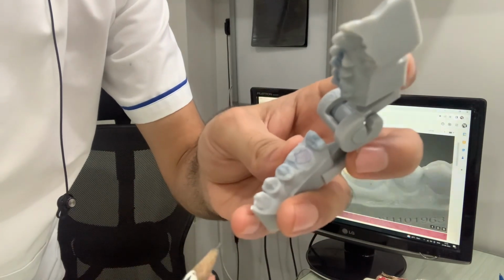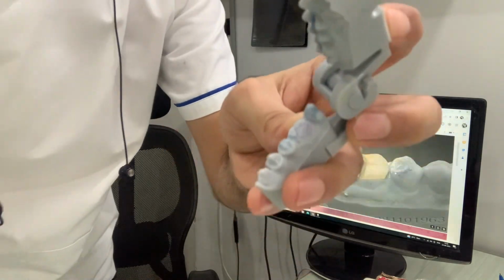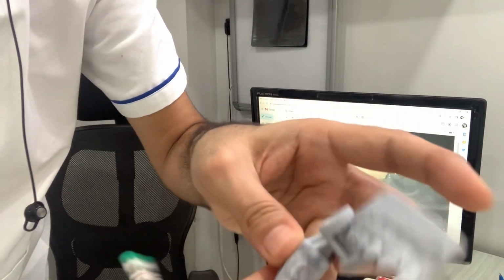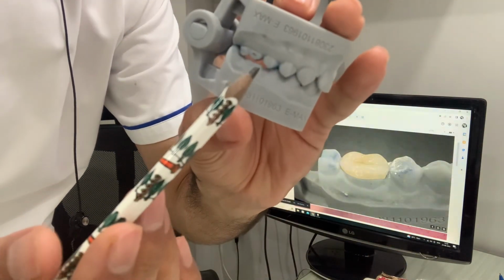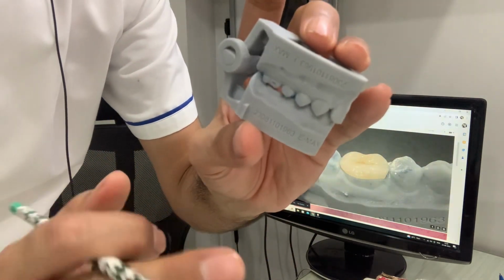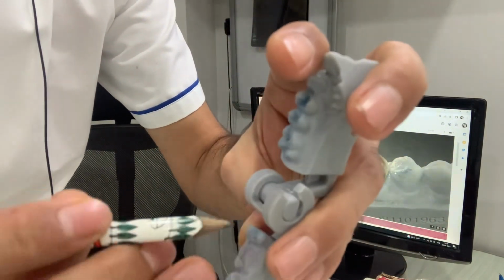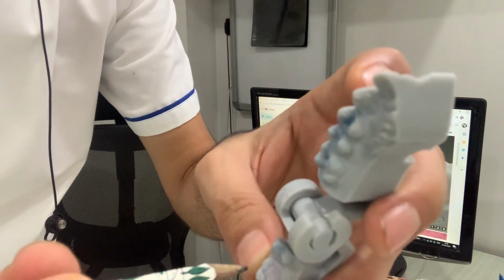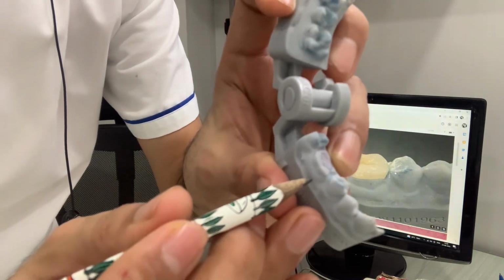The best we can do for the patient is get an Emax onlay made. What I did is I have just performed the occlusal reduction. Just see, there is a space of around 2 millimeters. I have done an occlusal reduction of about 2 millimeters. I have prepared the tooth for receiving an Emax onlay, and I have not even touched the buccal surface, the buccal wall.